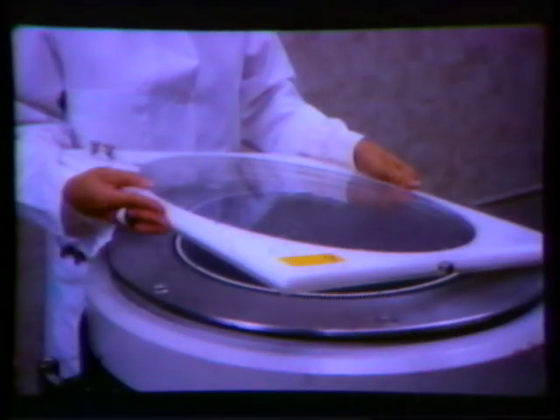Uniformity, or flood field uniformity as it is sometimes called, is the ability of a gamma camera to accurately produce an image of the data it detects. It is tested by imaging a uniform source placed in front of the detector. The resulting image should show a uniform distribution across the entire field of view.